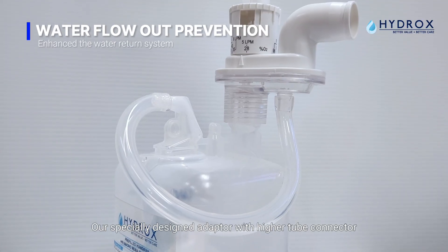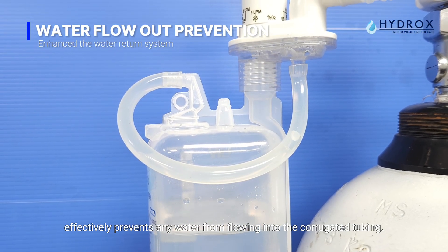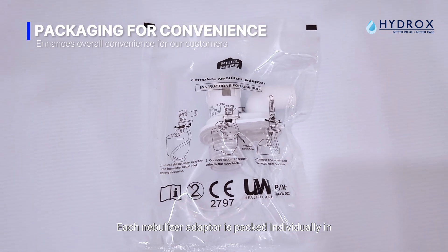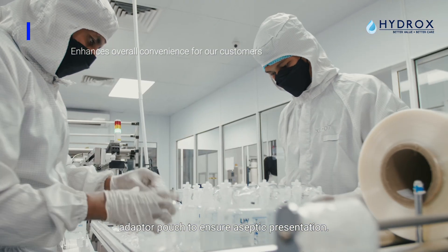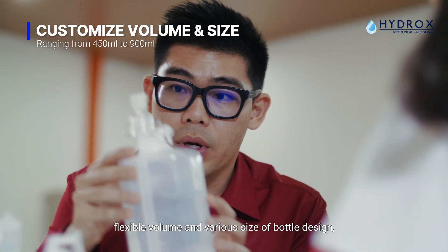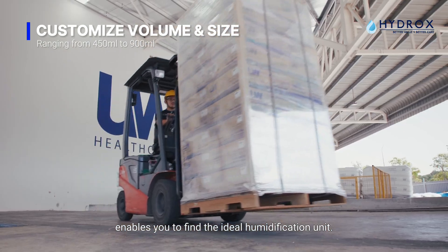Our specially designed adapter with a higher tube connector effectively prevents any water from flowing into the corrugated tubing. Each nebulizer adapter is packed individually in an adapter pouch to ensure aseptic presentation. To cater for different requirements, we offer flexible volume and various bottle sizes, enabling you to find the ideal humidification unit.